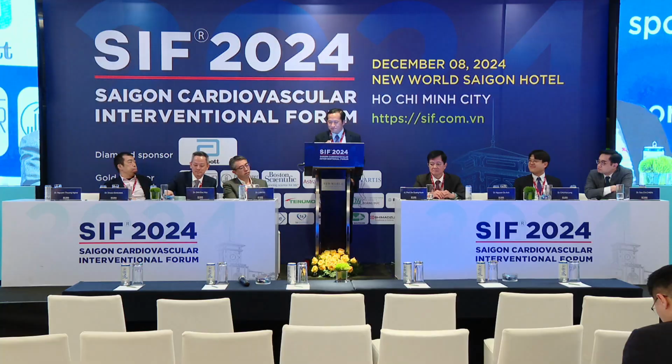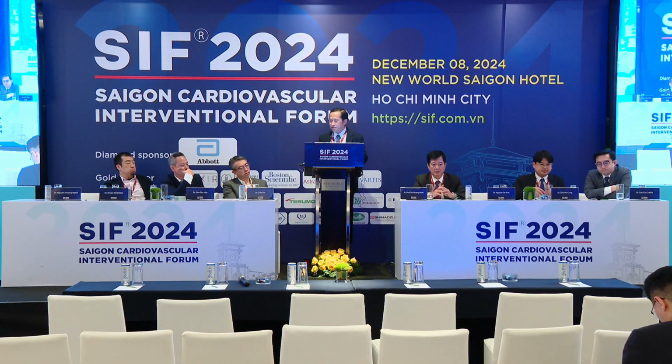Very good question. Thank you. For the jail balloon technique, there are 2 risks. One risk is the malformation of the stent, and the other risk is the balloon being entrapped. So we should use a very good balloon, a small balloon, with the size of the balloon less than the size of the side branch and a half millimeter. And the length of the balloon is long enough so that the proximal end of the balloon is at the same level as the proximal stent. Yes.